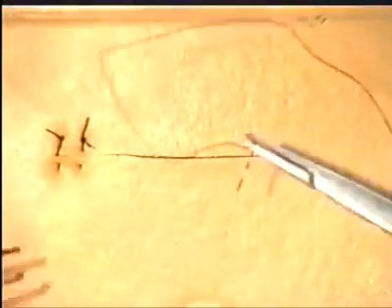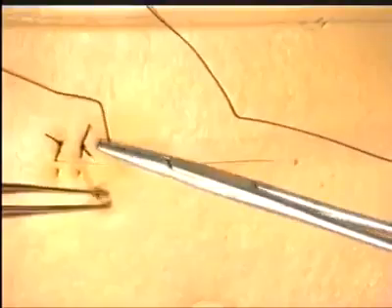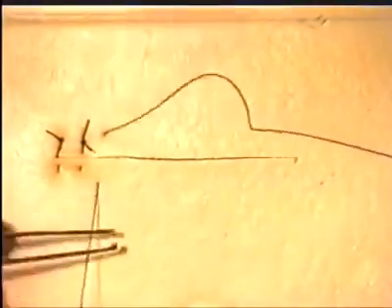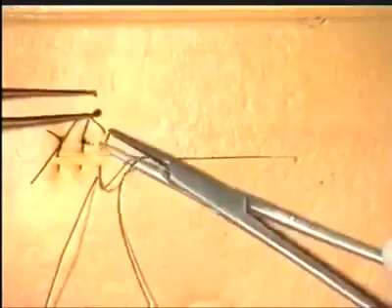Let's insert just one more vertical mattress suture. In at right angles. Reverse the needle. And then going back, just taking the wound edges as seen.